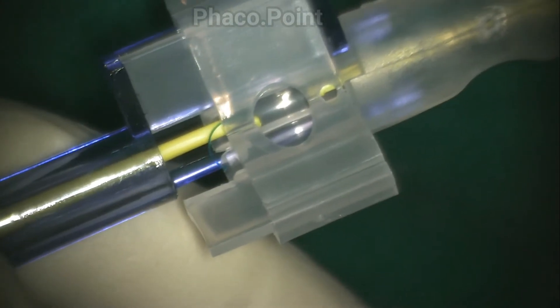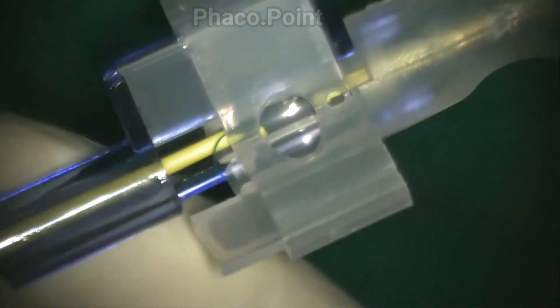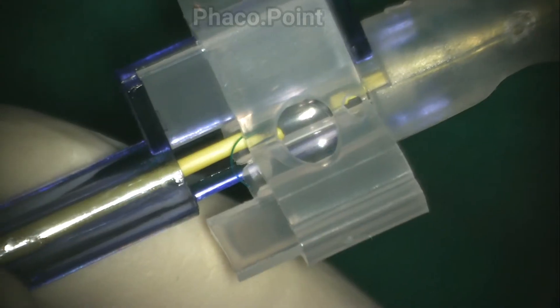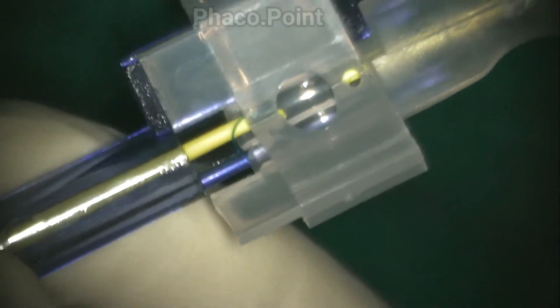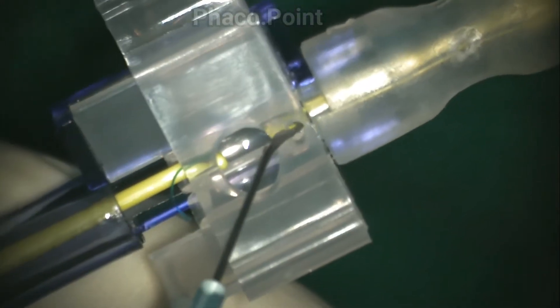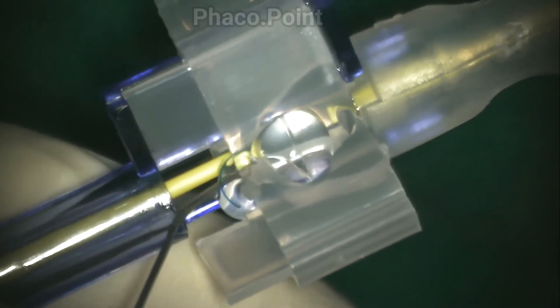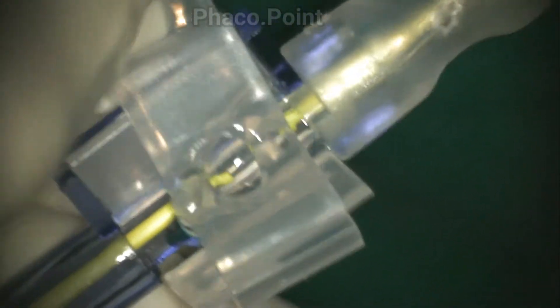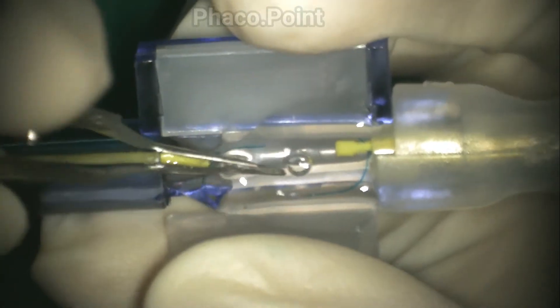Once more, fill in some viscoelastic. This is a three-piece IOL made by Oralab, which comes with a pre-loaded butterfly-type cartridge with a push-type injector. Observe the position of the IOL in its housing. To prepare the IOL for insertion, plain HPMC viscoelastic is introduced into the cartridge that houses the IOL.